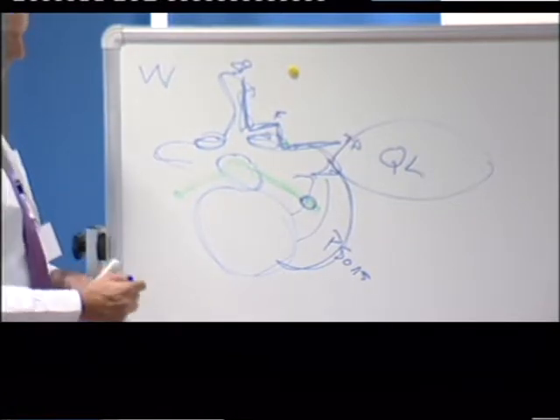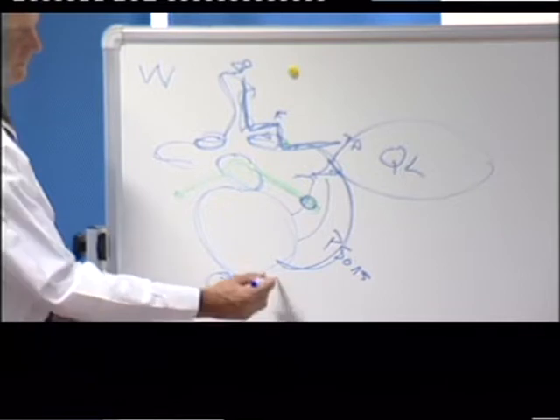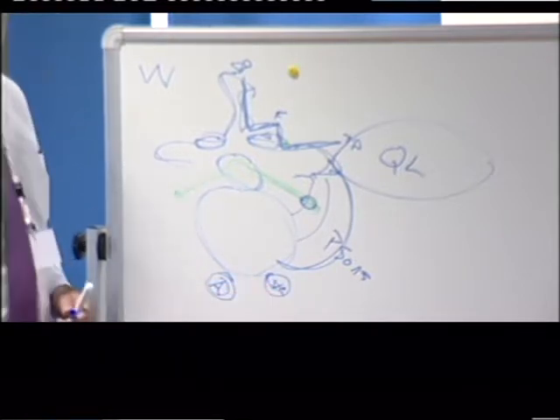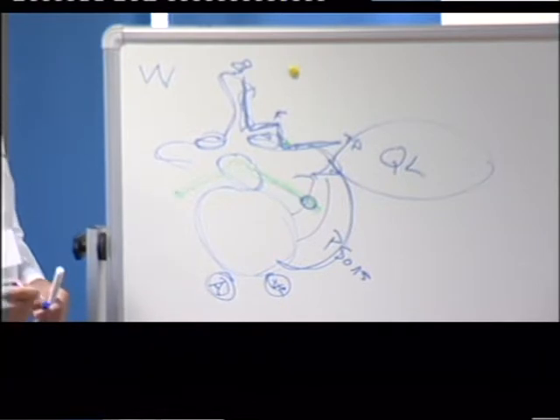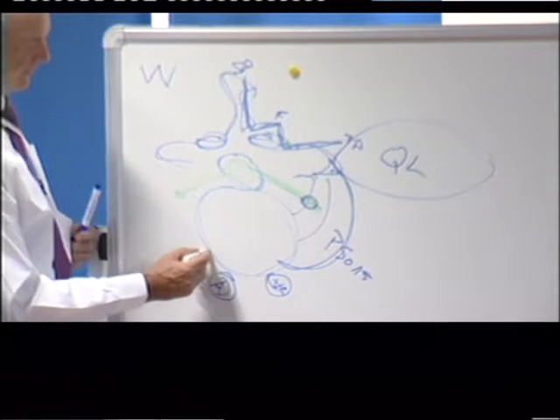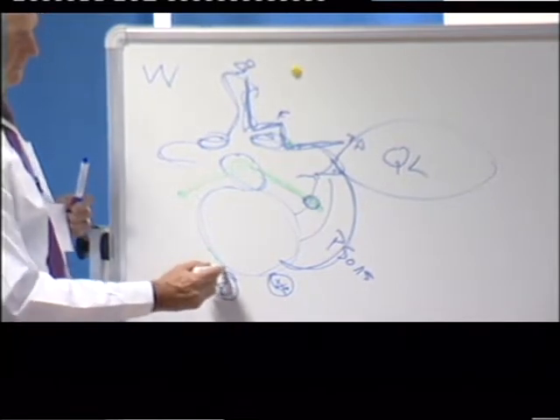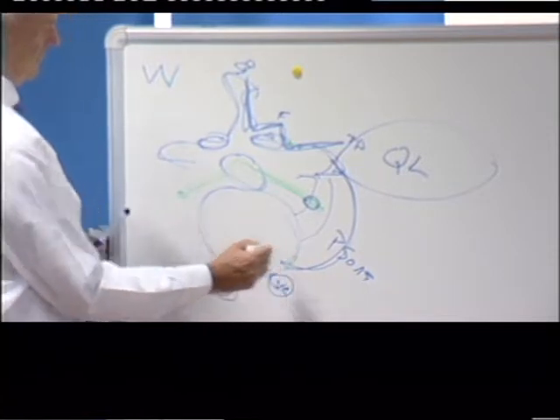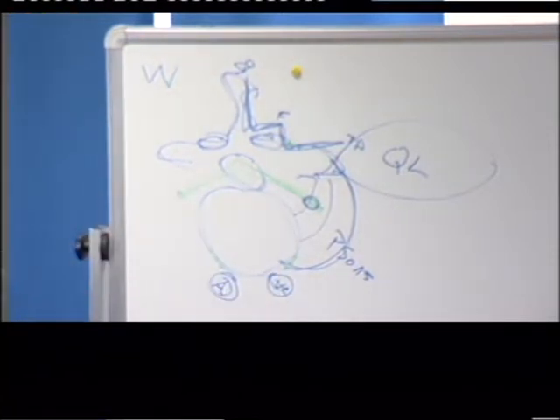And then you have aorta, vena cava, depending on where you're scanning, aorta or vena cava. And then here will be the sympathetic chain. Catena del simpatico sulla parete anteriore del corpo vertebrale.